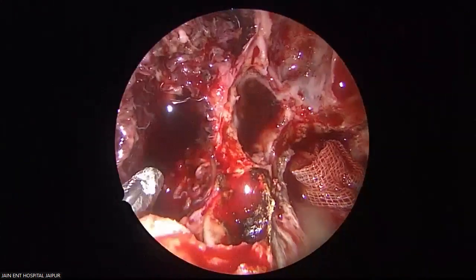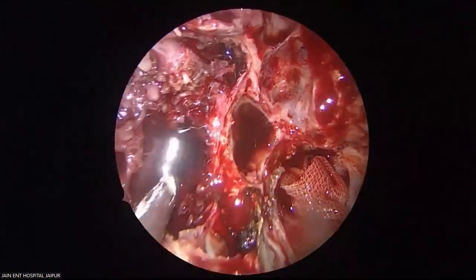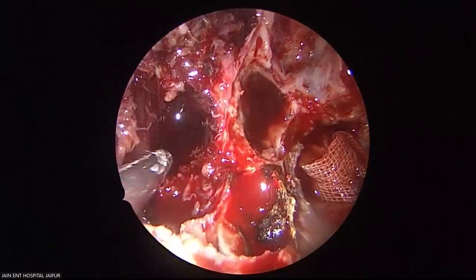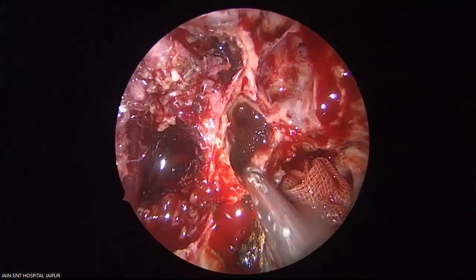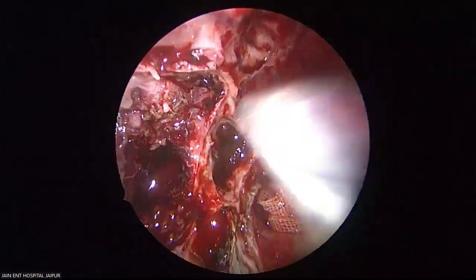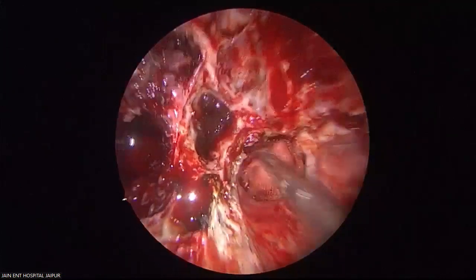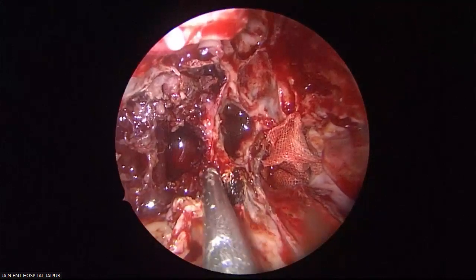See now, this is your infratemporal fossa with my Surgicel in place. Pterygoid with the Surgicel in place. Sphenoid, Onodi, superior orbital fissure, everywhere. Give me a small Surgicel more.